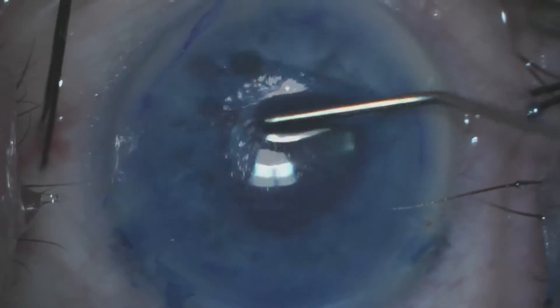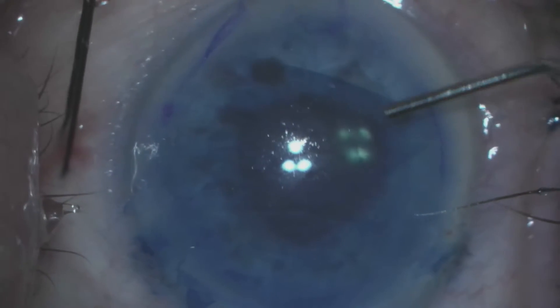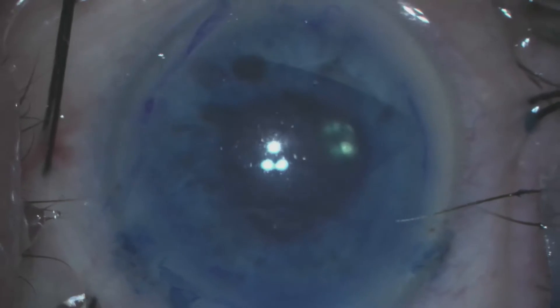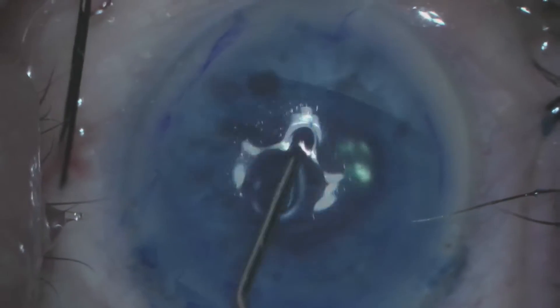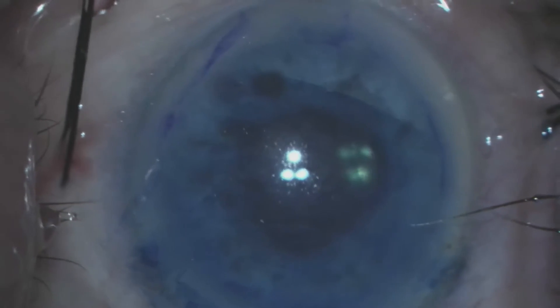We shallow the anterior chamber and using our cannulas we gently unfold the scroll. In order to determine if the scroll is in the correct orientation with the endothelial cells facing the iris plane, we use a handheld slit lamp to visualize the scroll.